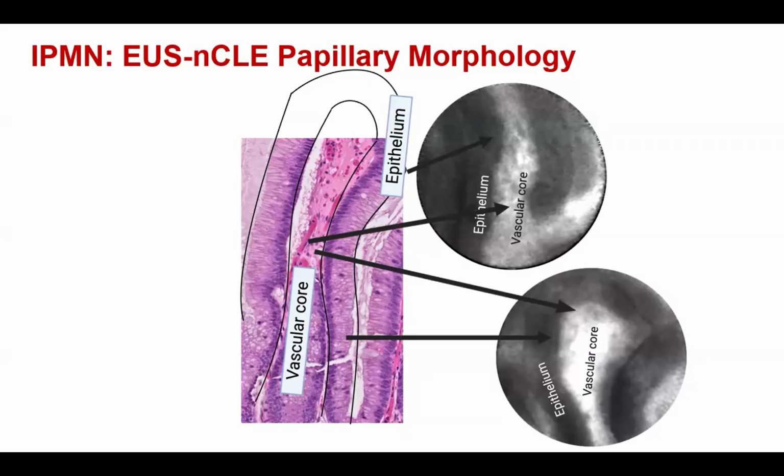And if you remember the slide where I showed there is a 3-dimensional approach to EUS, meaning that once you're doing endomicroscopy, once you are located in a specific site within the cyst, do not forget to rotate around your body axis to get additional imaging from the other parts of the cystic lesion. So again, the probe is going to disappear from your EUS view, but then you'll be capturing video from other parts of the cyst. So what I've learned during this process of endomicroscopy and RFA is that EUS is three-dimensional, and you should not forget that when you target these larger cystic lesions.